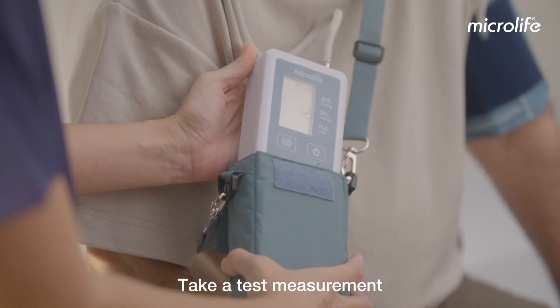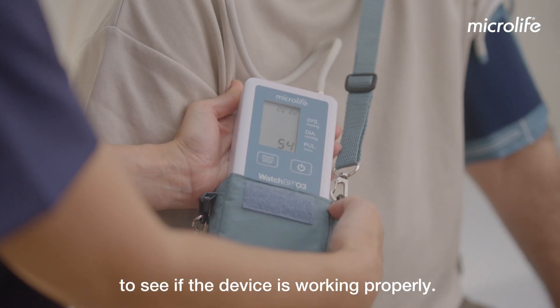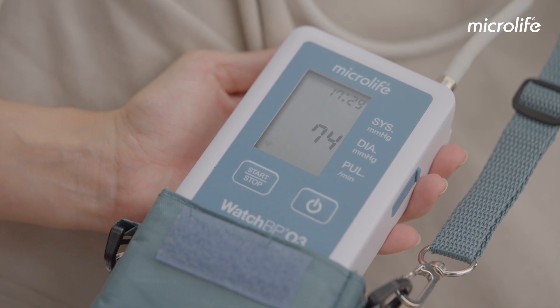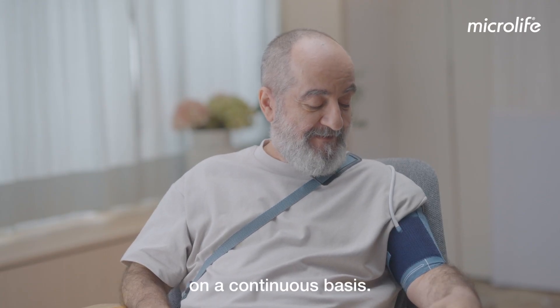Take a test measurement to see if the device is working properly. Your blood pressure is accurately measured on a continuous basis.